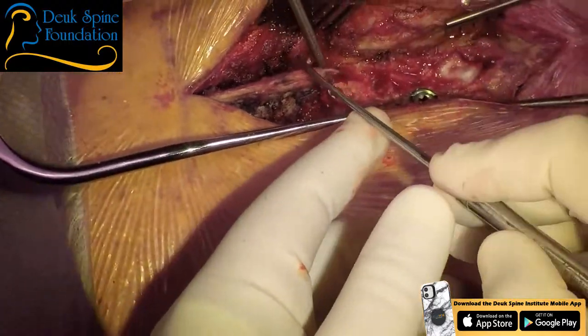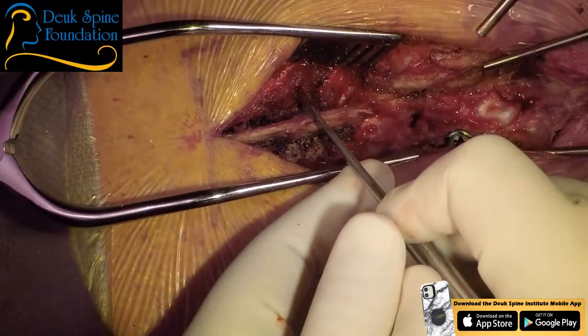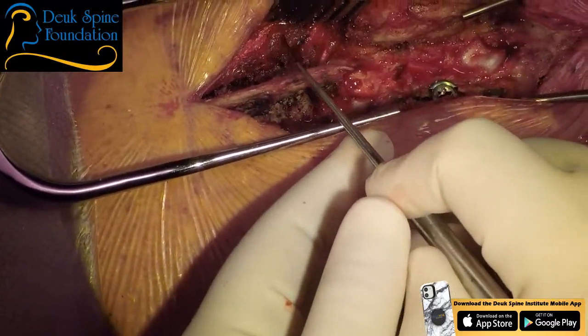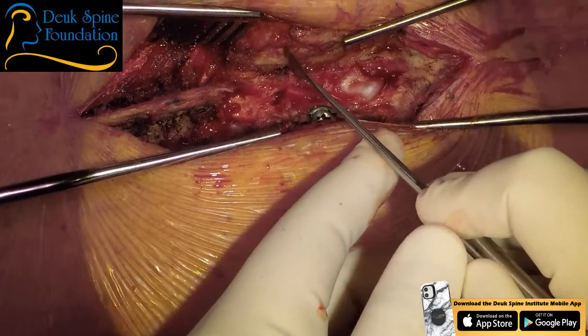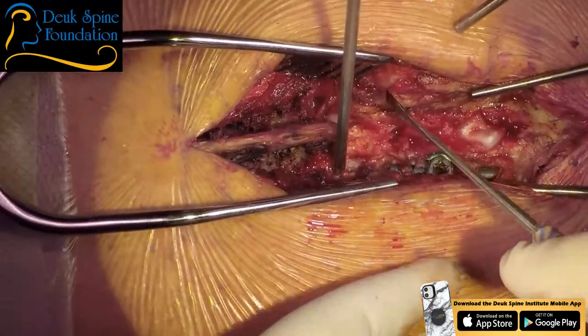And I want you to look here. This is muscle that we just dissected off the spine. It's never been touched before. Look how beautiful beefy red it is. And here is scar tissue that stuck the muscle back to the bone after the last surgery. And you can see it ends right here.